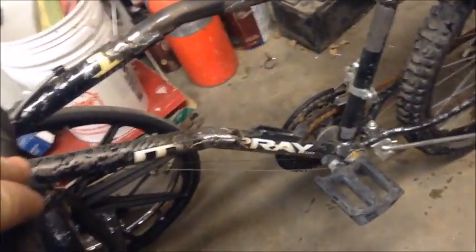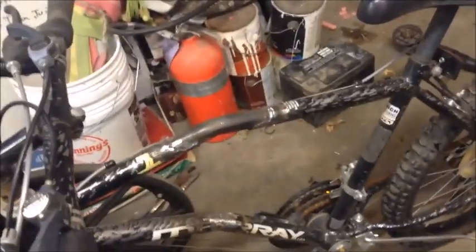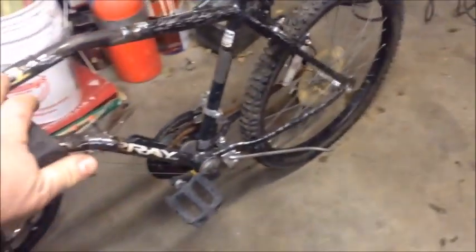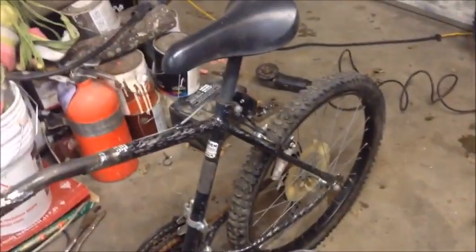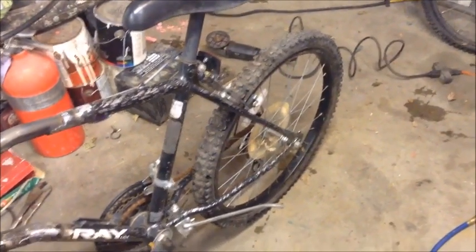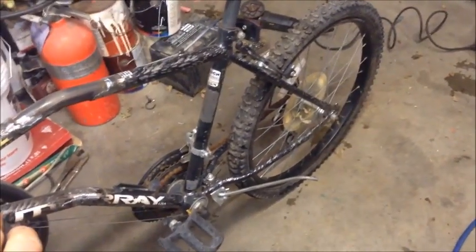Okay, so we got the bottom notch welded back in, got the backbone welded in, threw a little paint on that. You see, I did flip the handlebars so that whoever's sitting in there clears their head a little better. Oh, here's something to consider. Yes, you've got to be aware of this. There's no front wheel, therefore there's no front brake. There's a rear brake. So, ride accordingly.